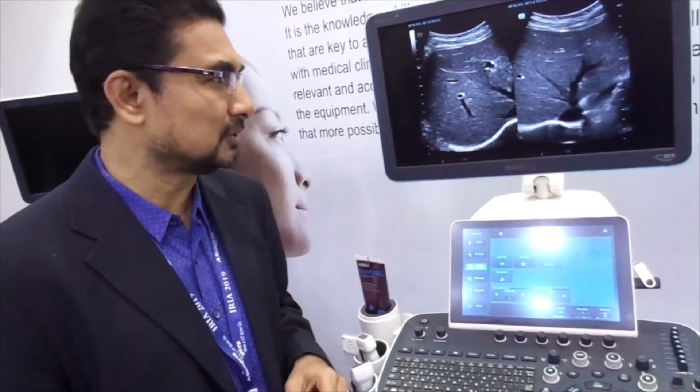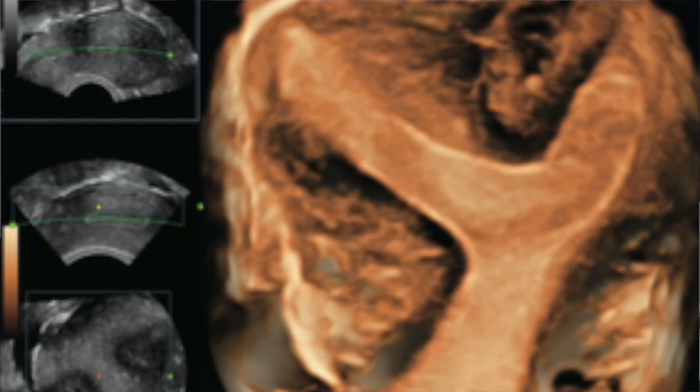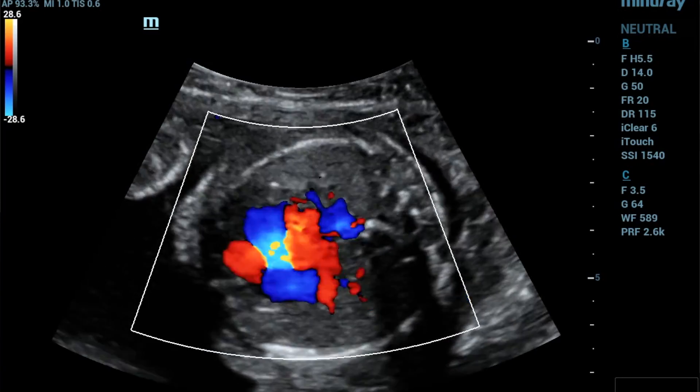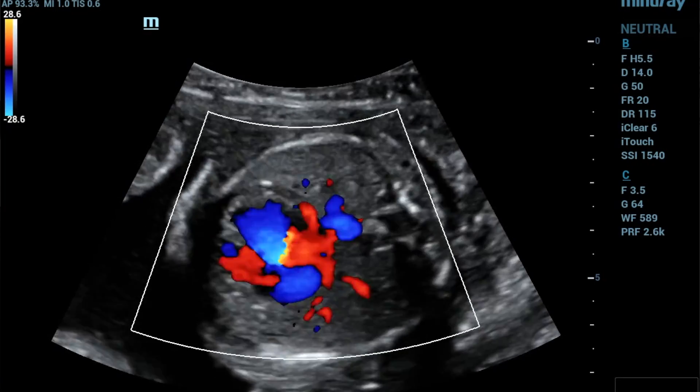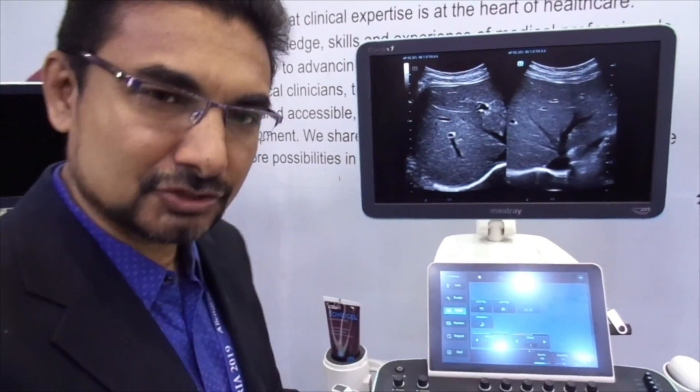The resolution is quite good. The Doppler is effortless — sometimes you actually get too much blood flow into the thyroid and things like that, but you can easily get the Doppler and adjustments are quite easy on it as well.